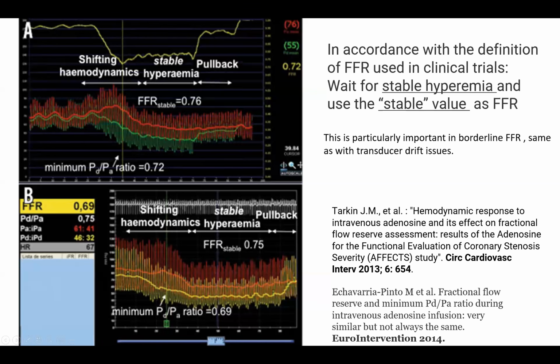It's an idea not much talked about, which is that frequently, in 20 to 30% of patients at the onset of hyperemia, and this idea applies for FFR, not for iFR. So at the onset of hyperemia, when you give adenosine, you get an initial nadir of FFR, which is followed by a higher steady state plateau of hyperemia. Okay, so big nadir initially, you get a more dramatic drop in that FFR value, then the FFR rises by a few points and stays more stable there.